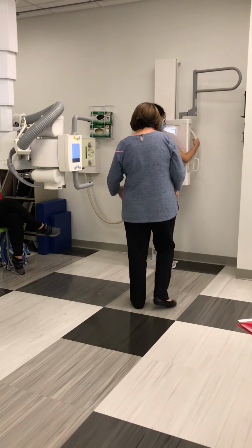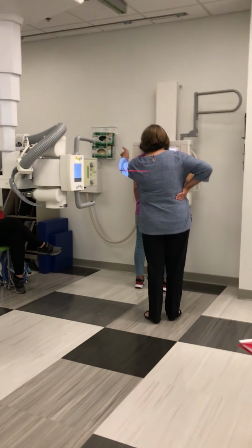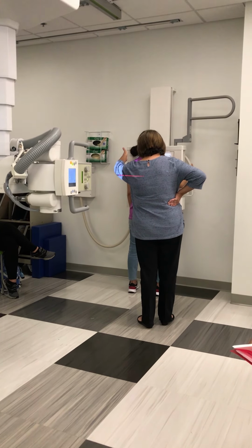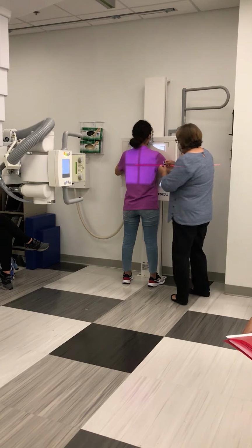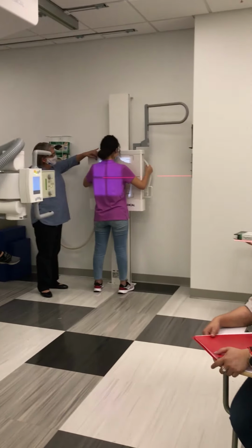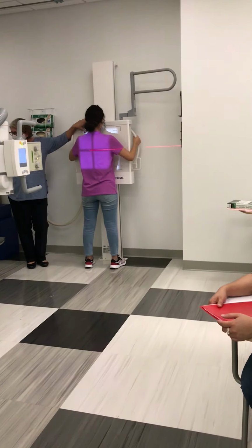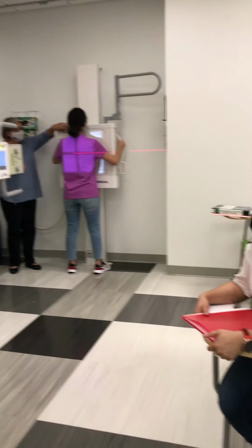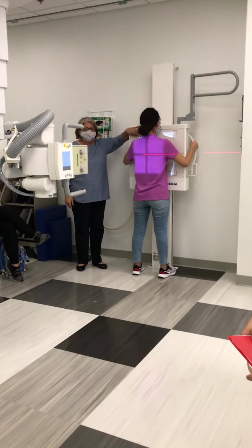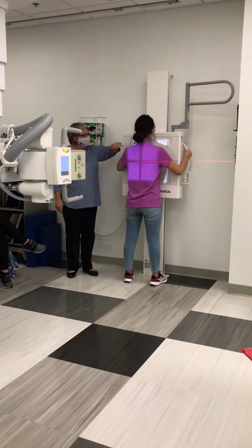All right. Now, grab that handle that's in front of you on your left as well. I'm going to use my left marker. I'm placing my marker in the light superiorly on this side.